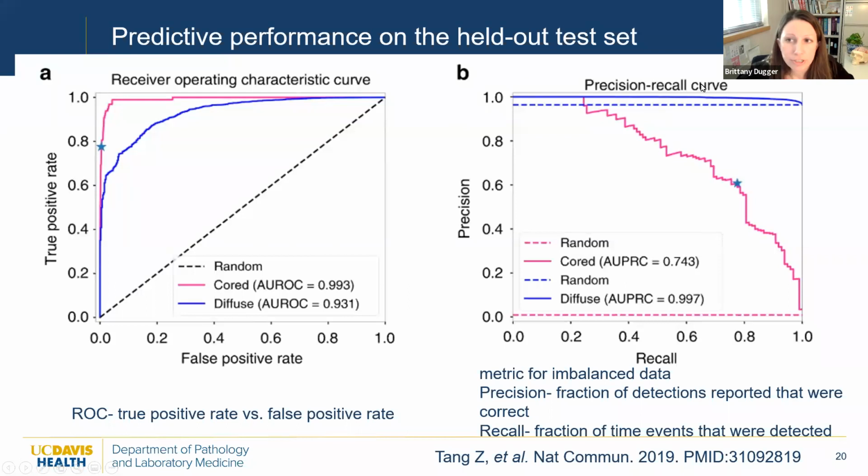And then you also have your precision recall curve. This is a good metric for imbalanced data, right? Because you want to factor in that recall. It's not just the fact that, oh, look, I did a whole bunch of great stuff, but I only had 7 things that I looked at. So again, nice little definitions down here for those where it's still early, you're drinking your coffee.